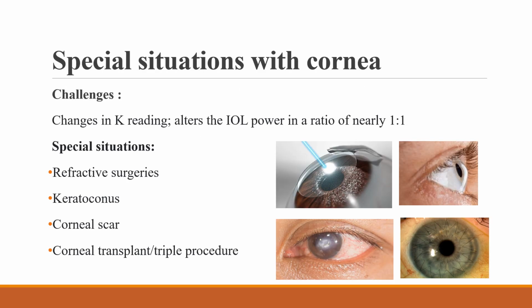Now we can discuss special situations with the cornea. Challenges are changes in K reading alter the IOL power in a ratio of nearly 1:1. The special situations are refractive surgeries, keratoconus, corneal scar, corneal transplant, or triple procedure.